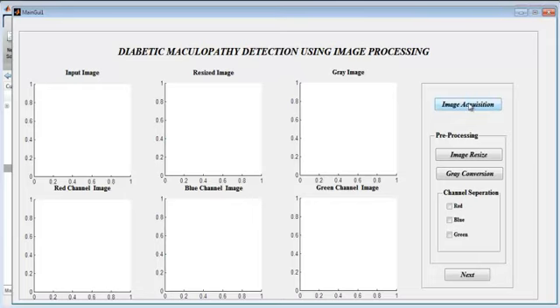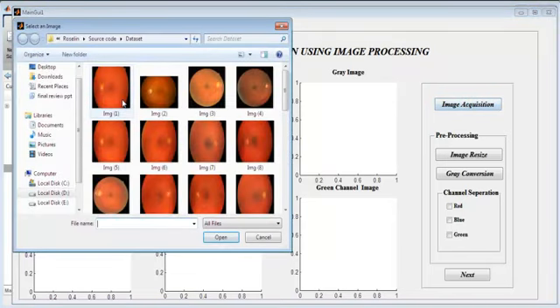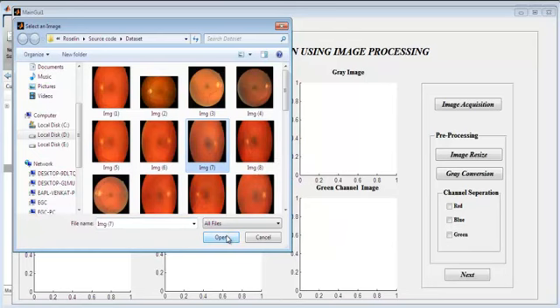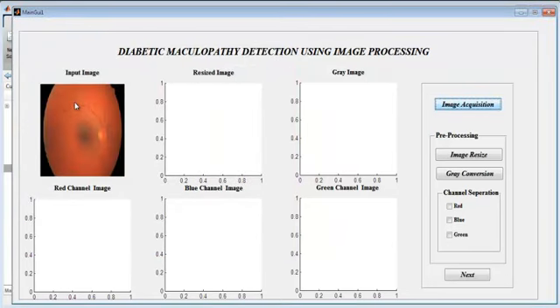Here we have image acquisition — that is, the input image we are going to fetch. Then we do pre-processing techniques like image resize, grayscale conversion, and the RGB image is individually separated into red channel, blue channel, and green channel images. First, the image to be pre-processed is taken. Click on the image acquisition button and you will get a set of images — the dataset from which you can select your desired one. Give open, and the input image appears.